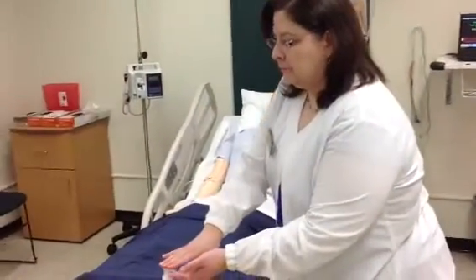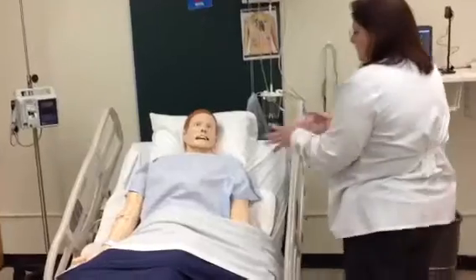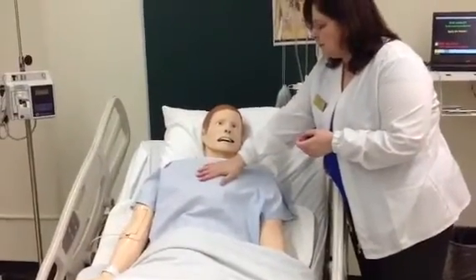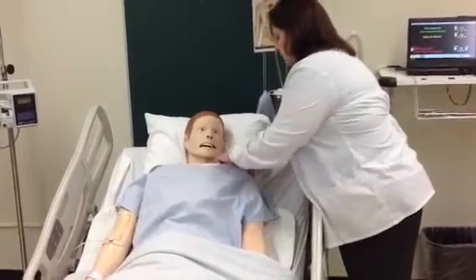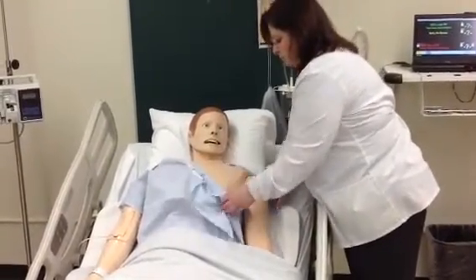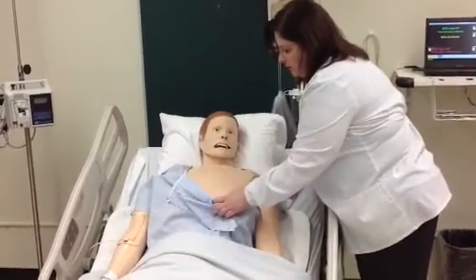So when you start with SimMan, he will be on. As you can tell, he does breathe, and blinks. So you can see that his chest does rise and fall.